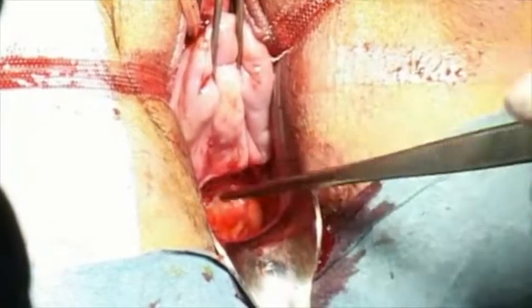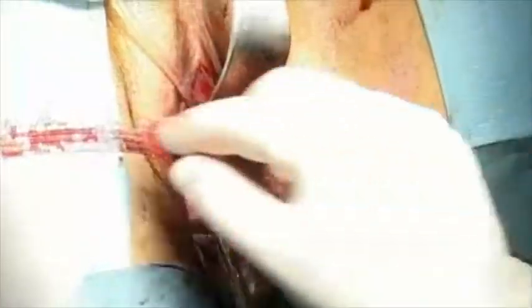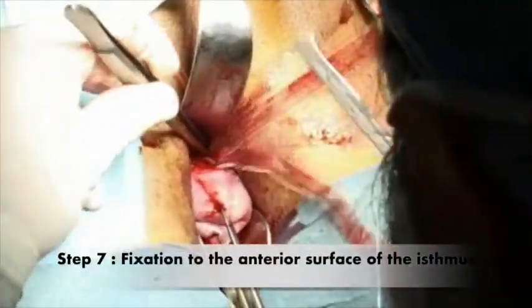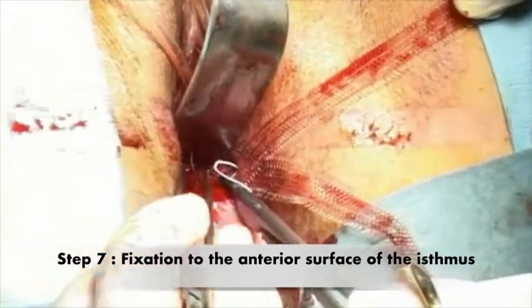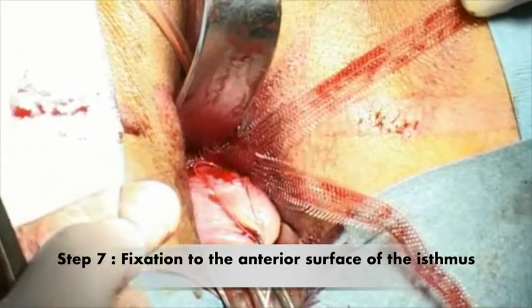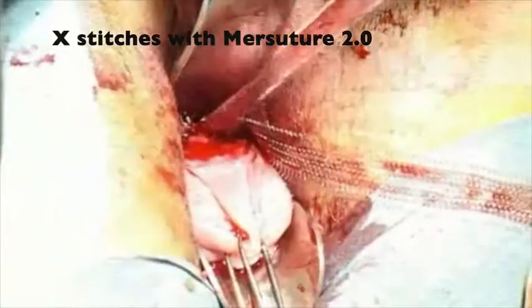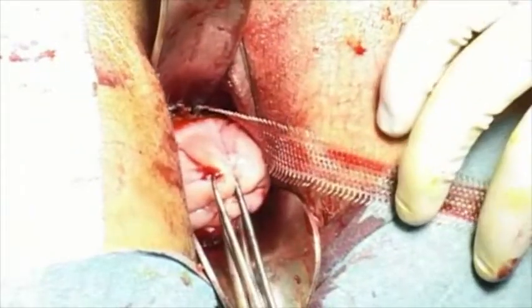The next step consists in placing the sling at the level of the isthmus. Traction of the sling is then performed in order to fix the sling on the uterus isthmus, using two non-absorbable suture stitches. The two suture stitches are performed to help maintain the sling in position. Once the two stitches have been tied up, the sling can be cut off.